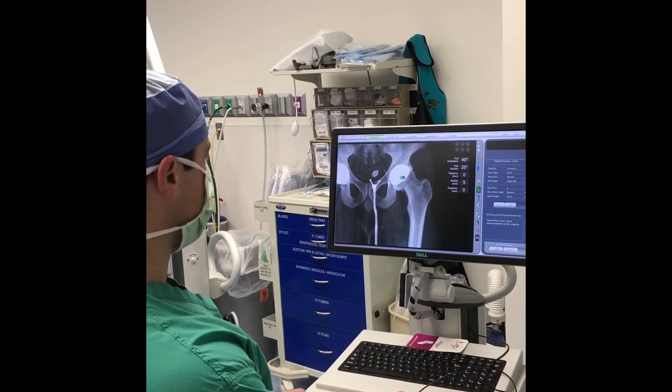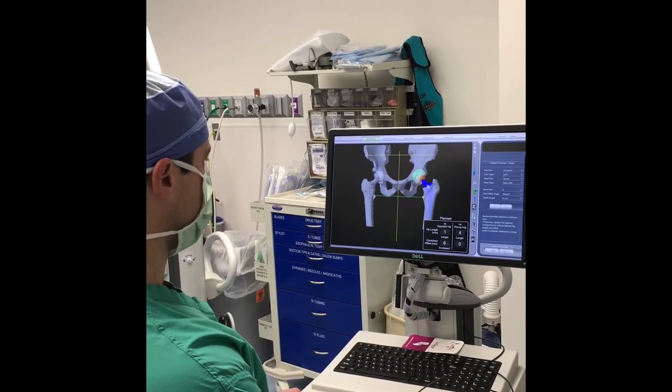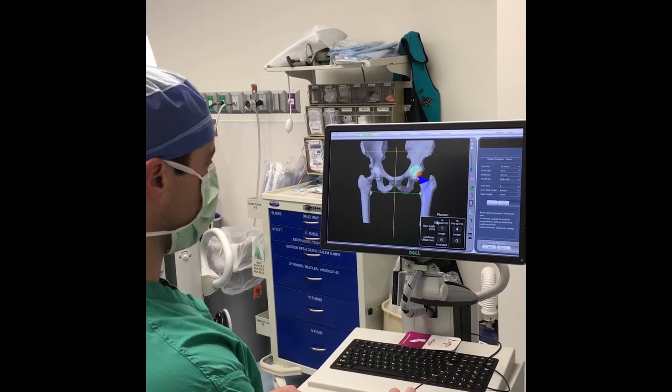This allows me to look at the planned hip center with the procedure, as well as what the stem will look like in place.